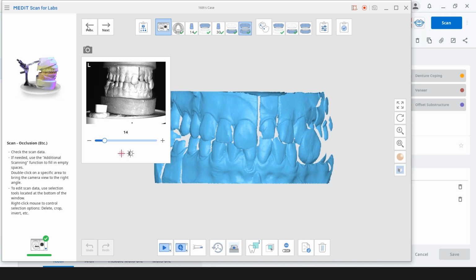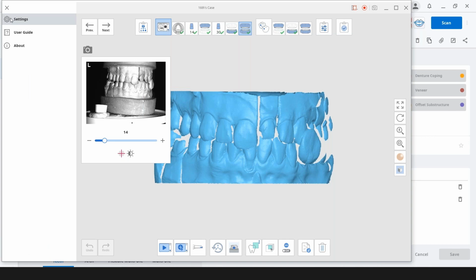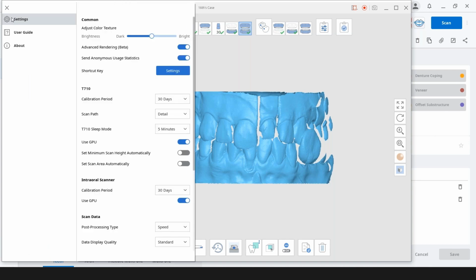Now, while you're here, can you show us where to reset your calibration default? Go to settings, and you can change the amount of time. If I click on those three lines, you can come in here and go to the calibration period and select any of these. So 30 days is default, correct? It's default right now, yep. If I click on that, it's going to go to 7, and that will remind you every 7 days, it'll go red and remind you to calibrate.